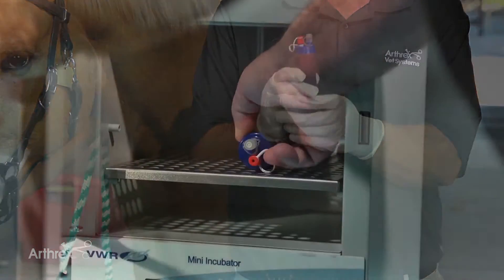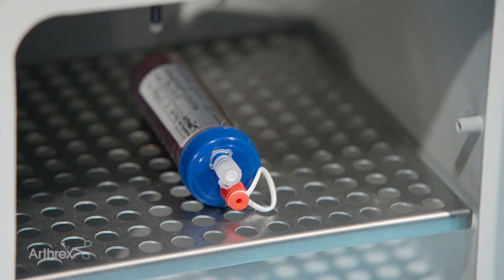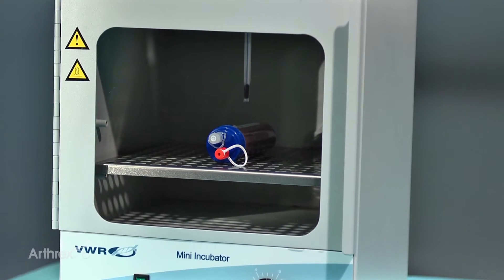After blood harvest, we go into the incubator with the red top down and we incubate for 16 to 22 hours at 37 degrees Celsius.